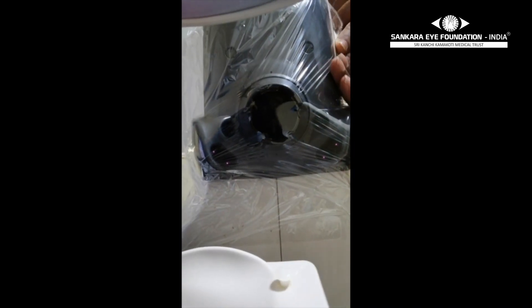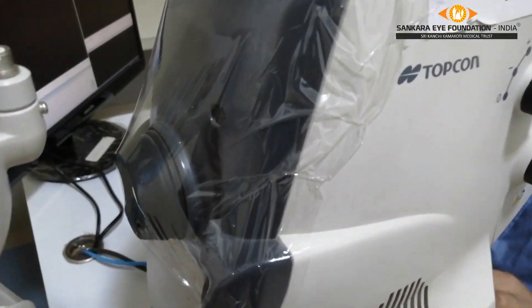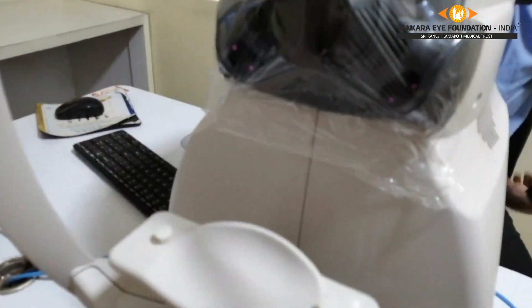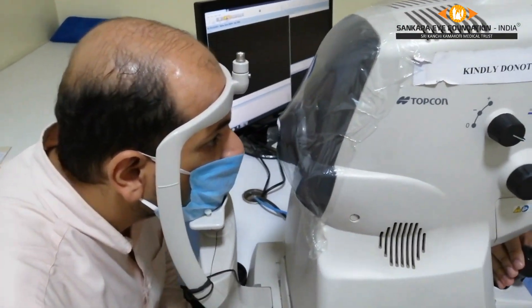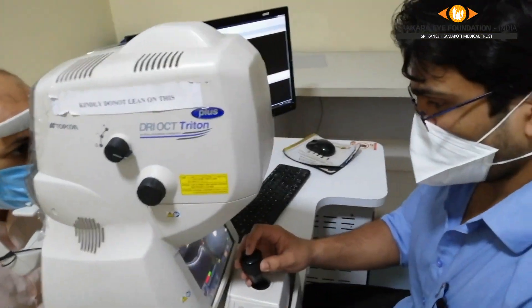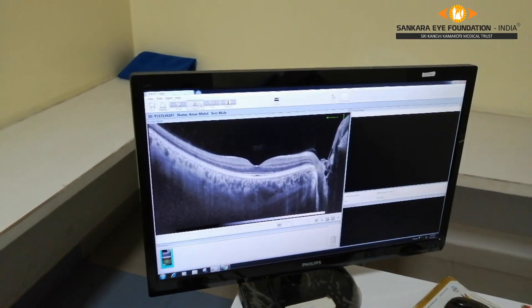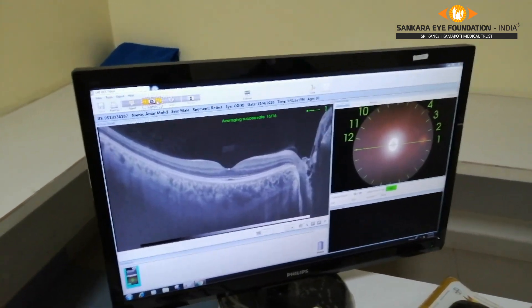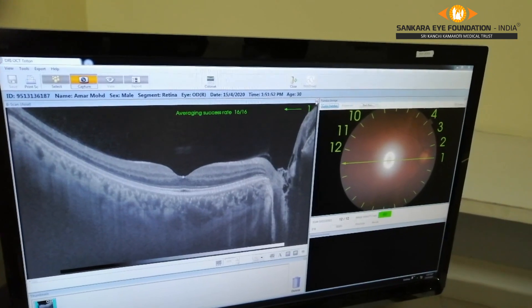Make sure there are no folds in front of the lens. This is a simple technique. The covering can be cleaned between patients and easily changed when required. As you can see, the quality of the scan is not affected, making this an easy to use, repeatable method.